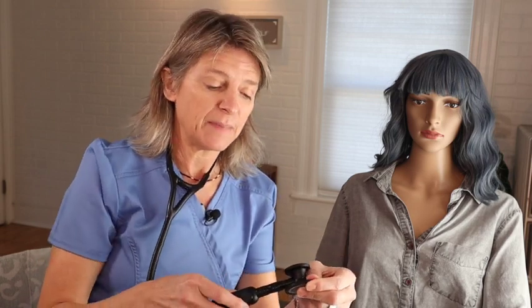So making sure that you can hear it and see it on your Echo app at the same time will make it a lot easier for you to understand abnormal heart sounds once you get to that.